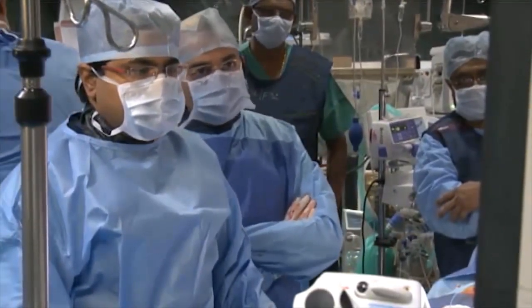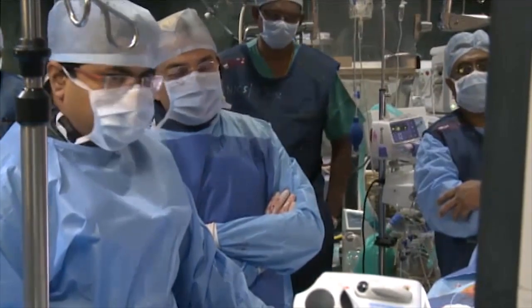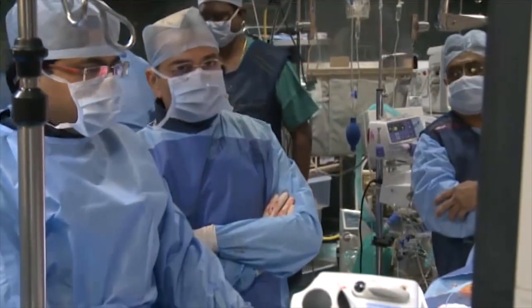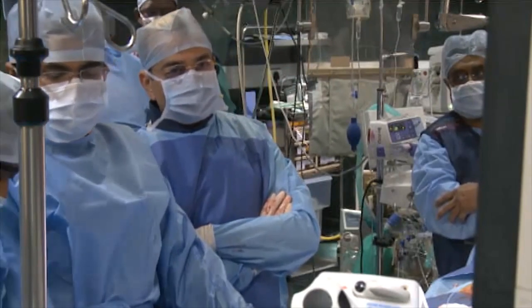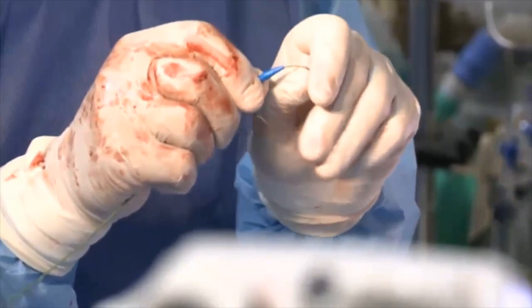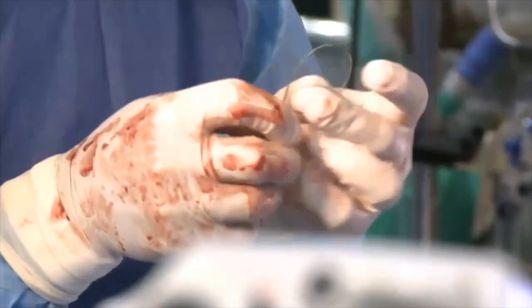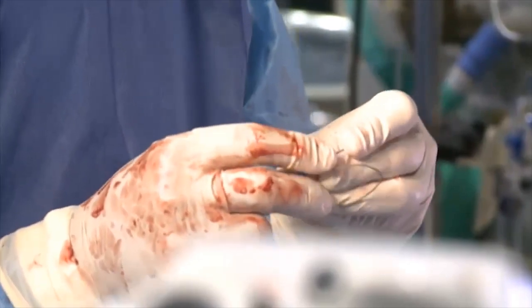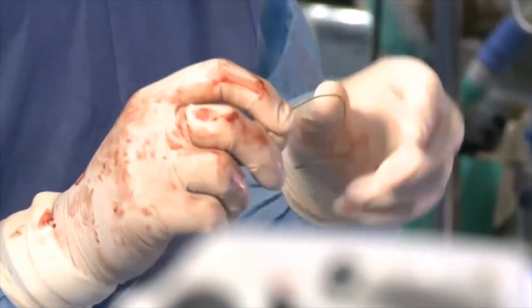Initially, we were planning we'll not do a pre-dilatation. I would leave most of the communication to be done by Ravindra because I want to concentrate on the patient, so I may be talking less. You guys can ask questions from Ravindra. My question is, maybe I would like to have an input from you, Dr. Parikh. What do you think, should we pre-dilate with this balloon valve or not? You look at the hemodynamic gradients. Are they visible to you on the screen?